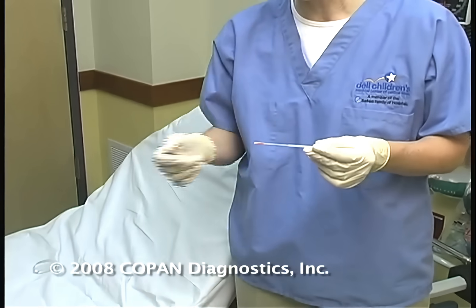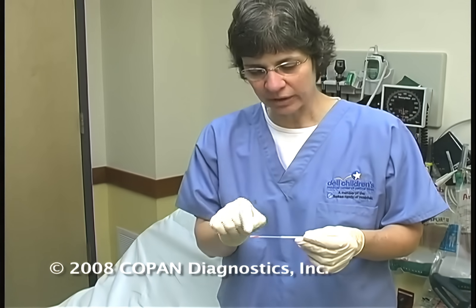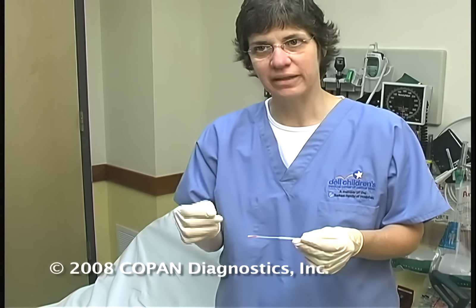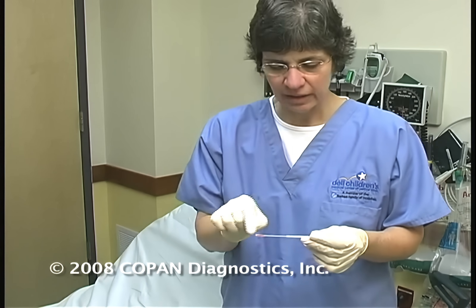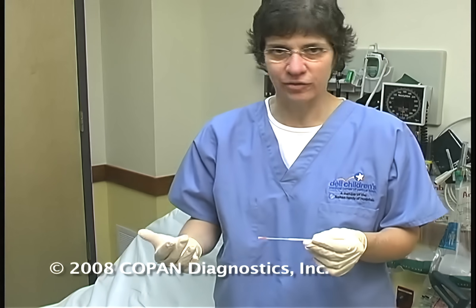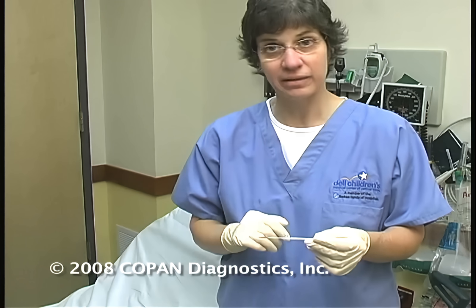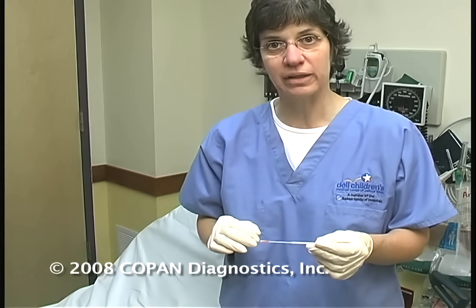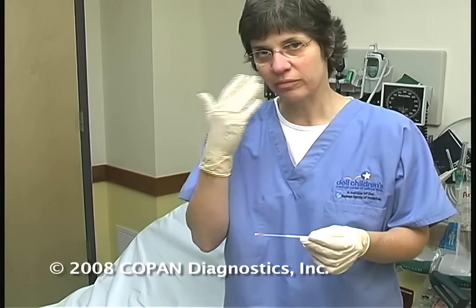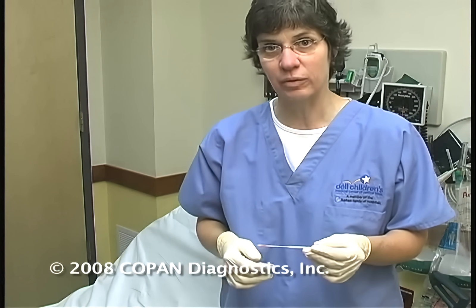Sometimes, as in the case with this last little infant, when they're fairly mobile — which the young toddler age is — you will get a little bit of blood on the swab just from the friability of the nasal mucosa. If you see a little bit of streaky blood like this, it's not a problem; it's not causing a major nosebleed. You just tell the parent that this is fairly common and happens frequently with just a little bit of movement of the child. There's nothing really to even take care of after the procedure — you won't even see bleeding from the nares.